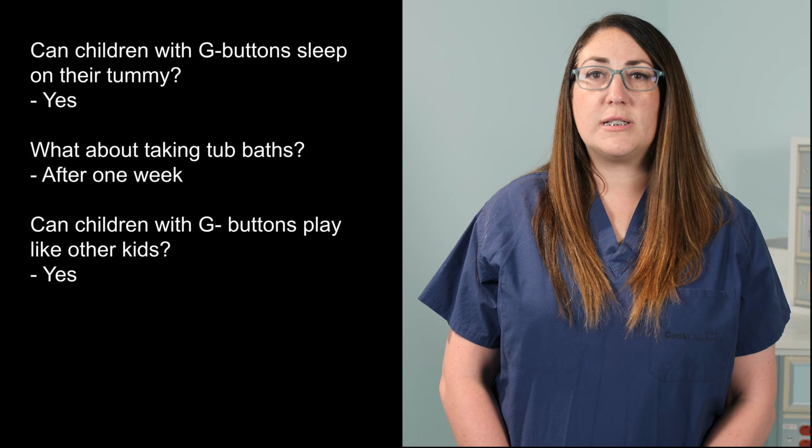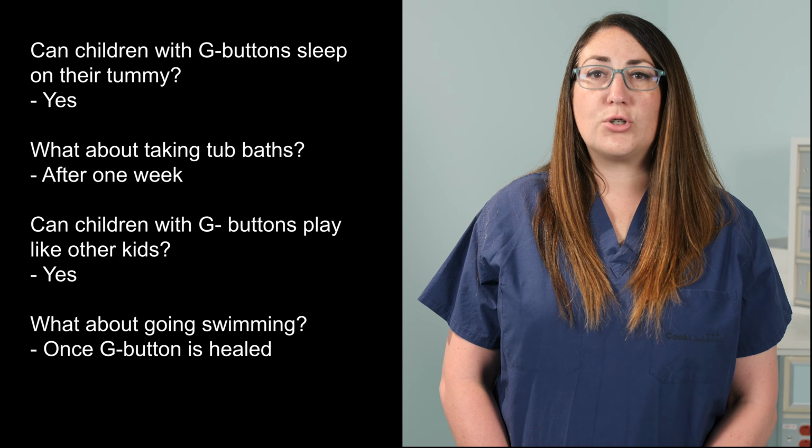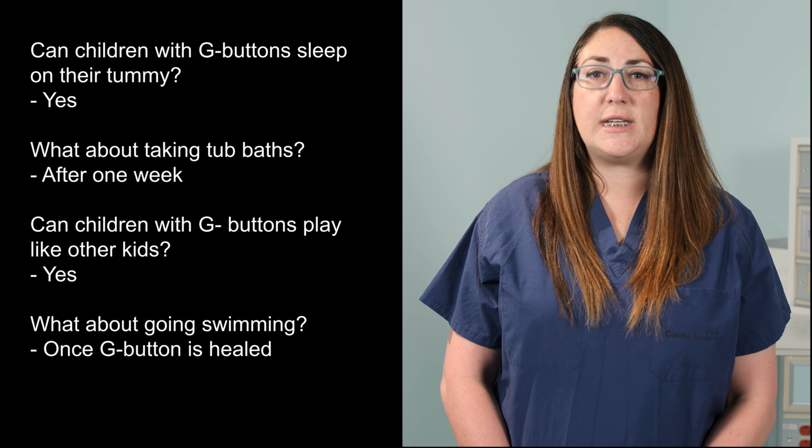Can children with G buttons play like other kids? Yes, children can do anything that will not hurt their tummy or pull on the G button. What about going swimming? Children may swim once the G button site is healed.